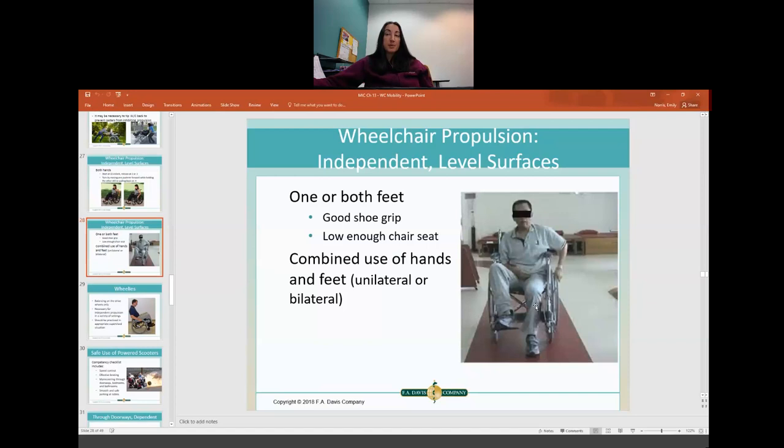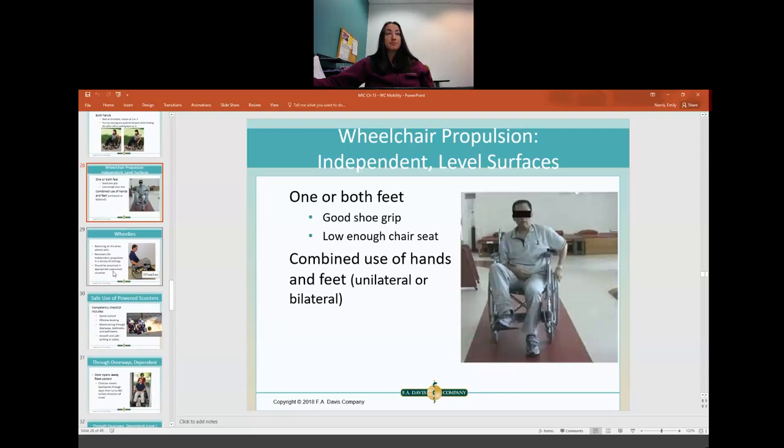If able, the patient can use their feet to propel as well. Especially with hemiplegia, they're only able to use one arm so they also use one leg to propel, combining their hand and that leg. It may be the opposite hand and leg depending on the injury — for example, a broken arm and broken other leg. Whatever they have available, you want to use it to teach them to independently propel the wheelchair.